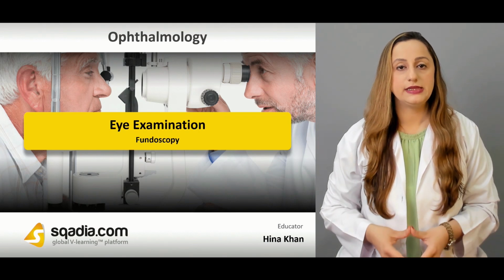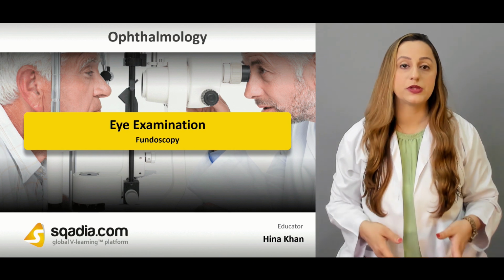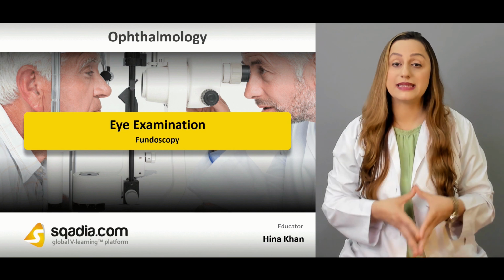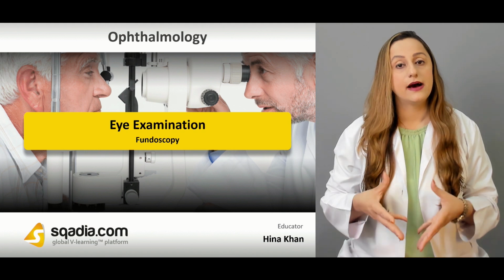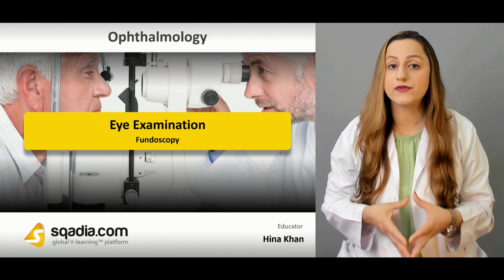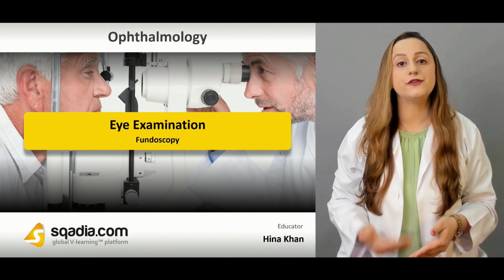Once you're done with the inspection of the eye, you have calculated the visual acuity, the visual fields, you have basically detected any abnormalities in the pupils or the pupillary responses or in the light reflexes, may it be the direct or the consensual light reflexes. You have noted down any abnormalities over there. Then you're going to move on to the fundoscopy.